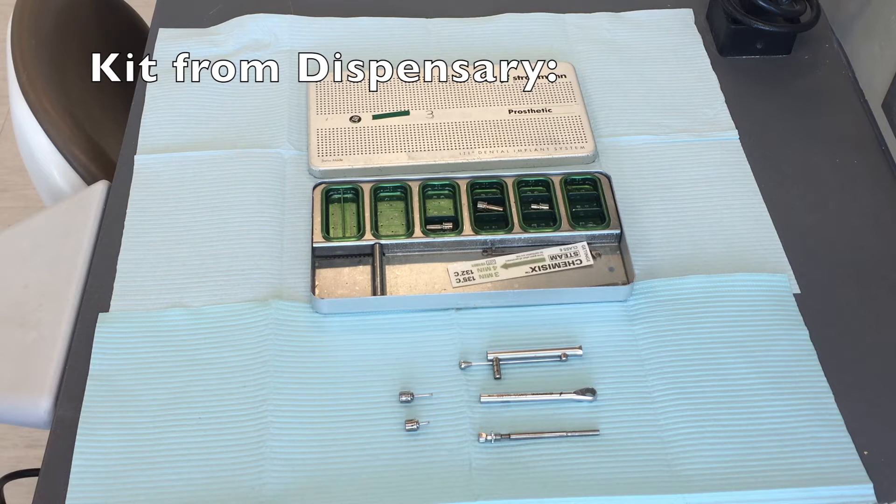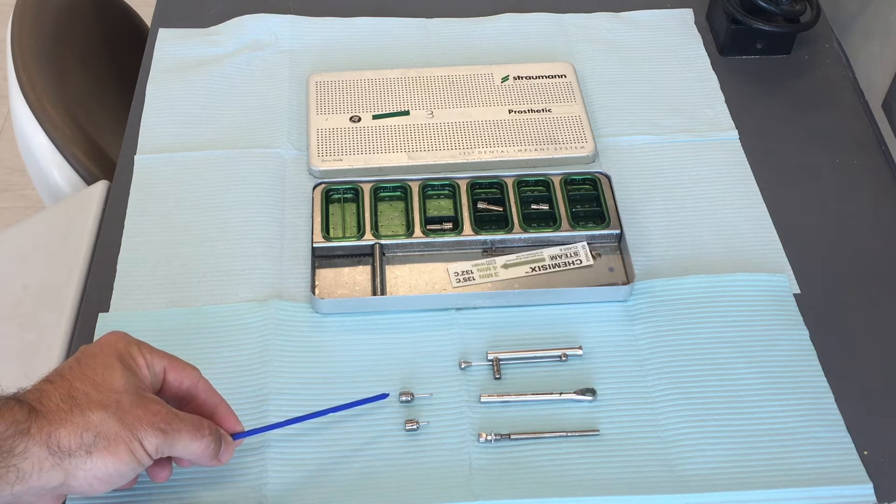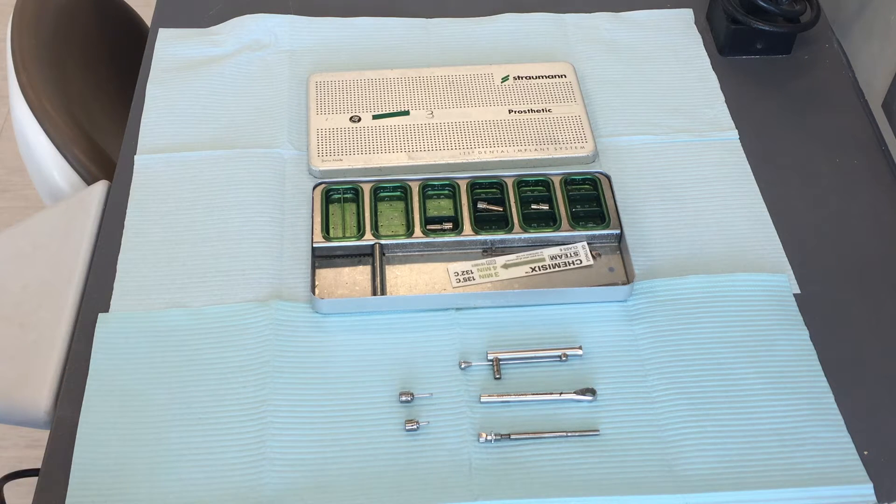When you go to the dispensary, this is the kit that you're going to get to assemble a Straumann torque wrench. You've got your long driver, your short driver, and then for the torque wrench itself you've got three pieces that you're going to need to assemble, seen here.